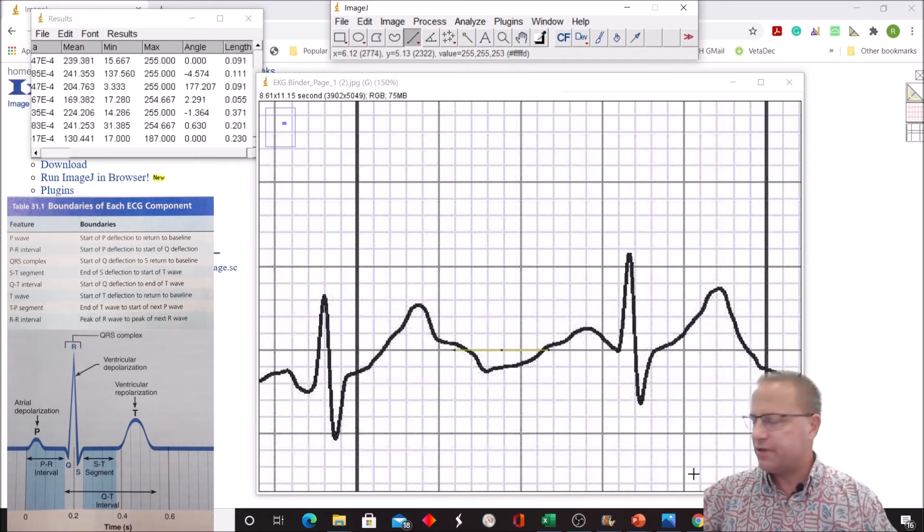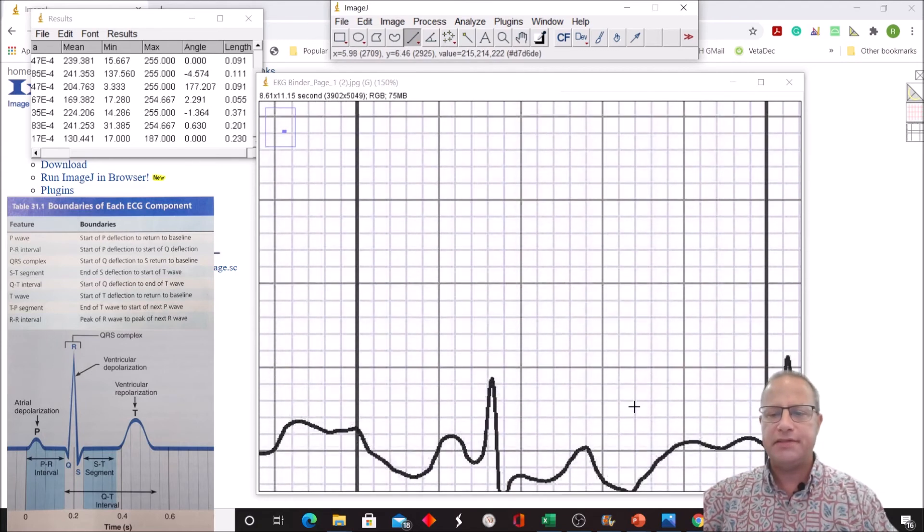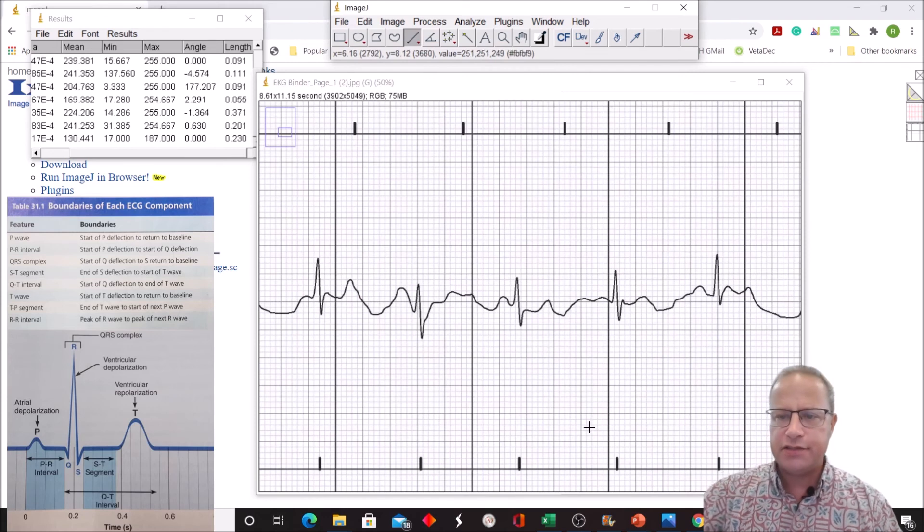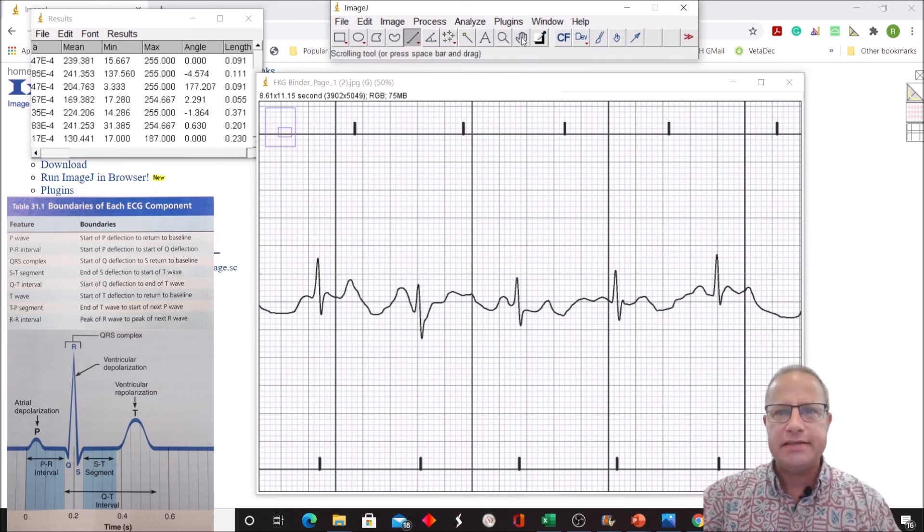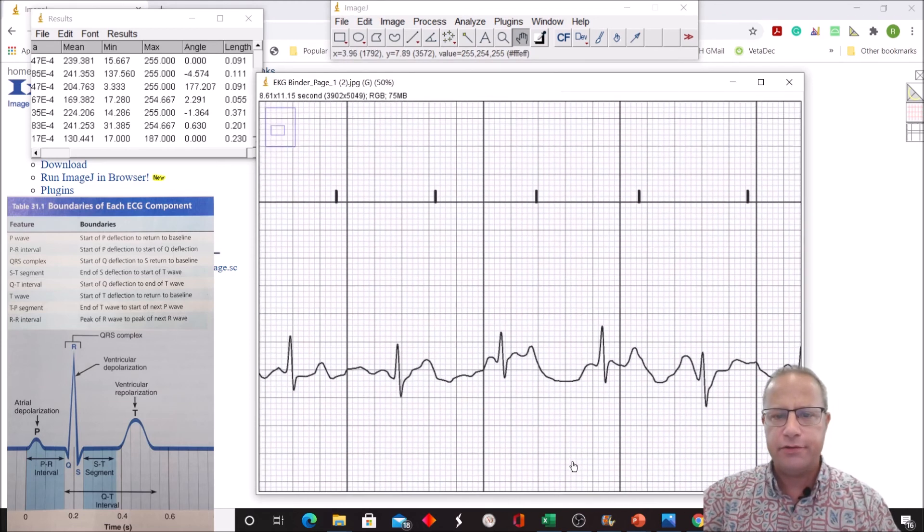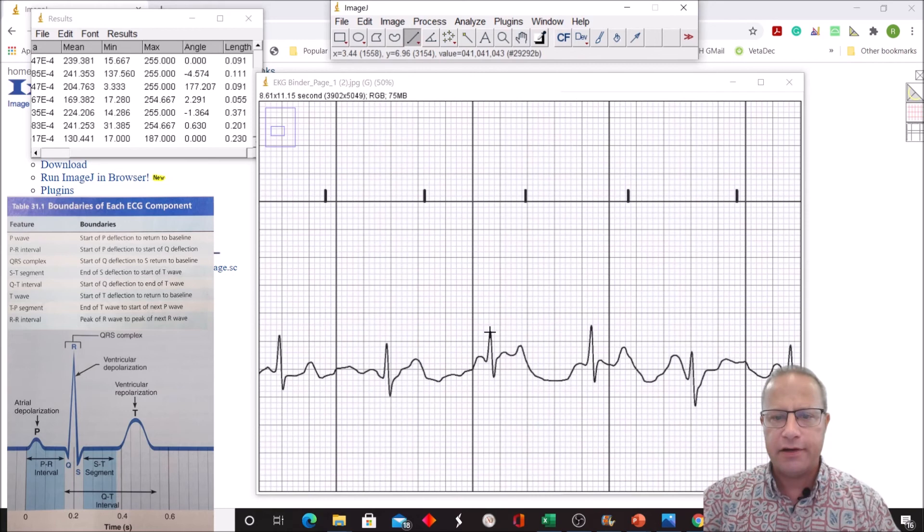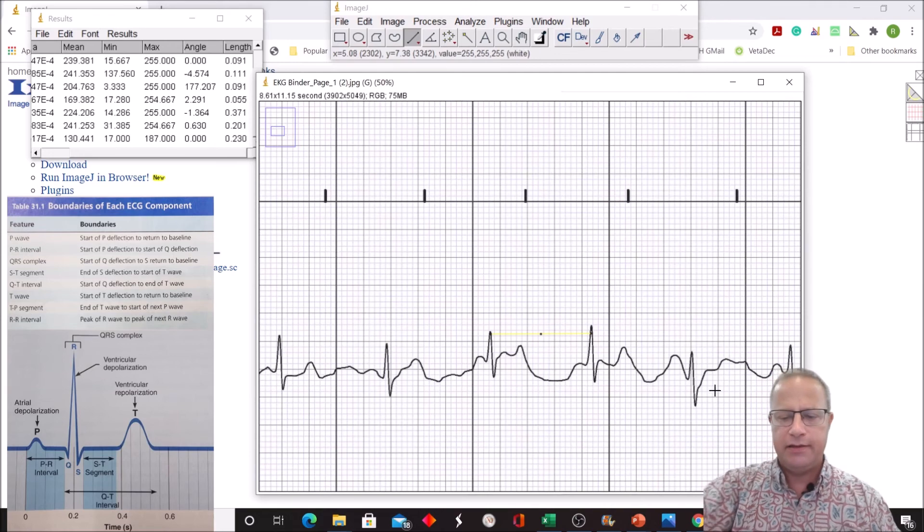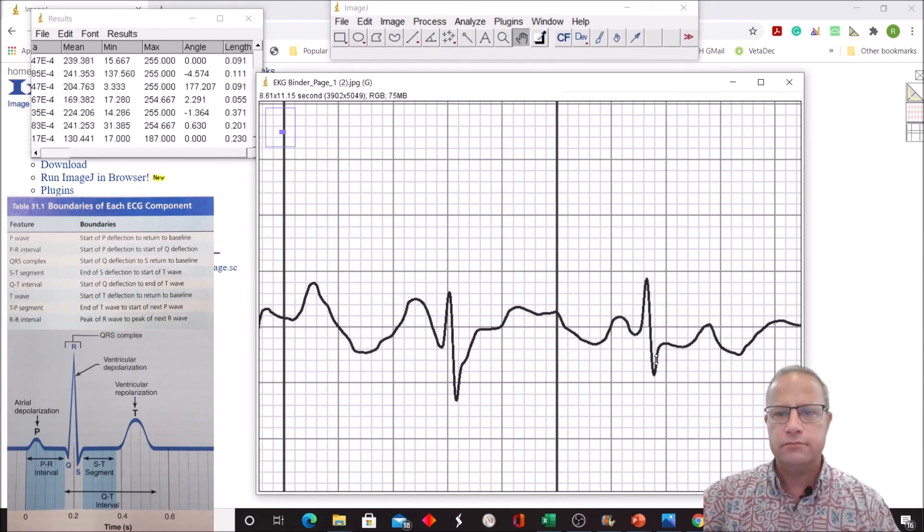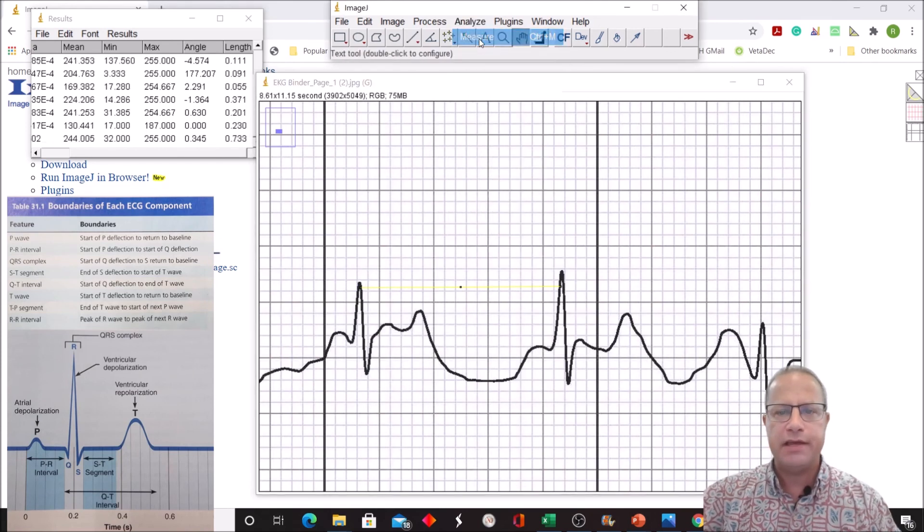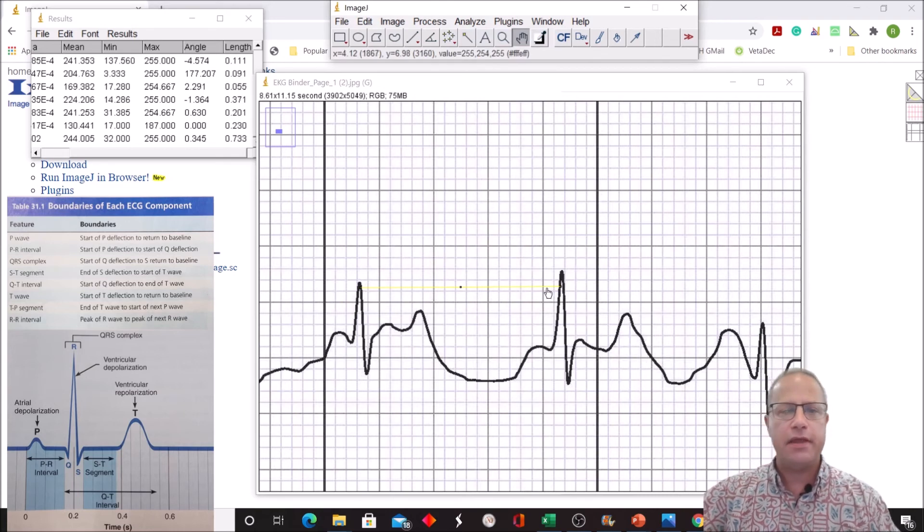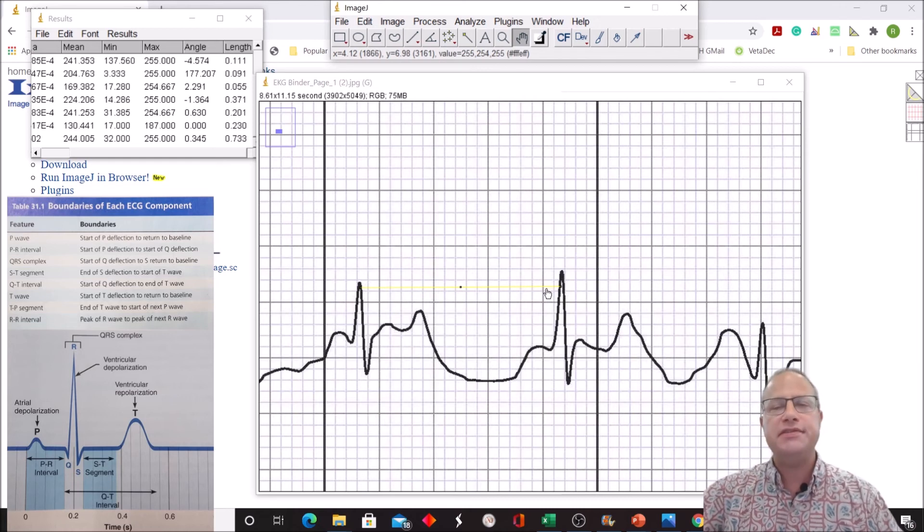Now we're going to go for something called the R to R interval, and this is really important because it helps us determine the heart rate. We're looking between adjacent QRS complexes, and this is one of the easiest things to measure. We can just find two QRS complexes and click and draw a line between the Rs. They don't have to be at the same height, just line them up like that. Zoom in to make sure we've gotten close. Then we just go analyze, measure. We get a distance of 0.733 seconds. This means the heartbeats are closer together than once a second, so it's going to be more than 60 heartbeats per minute.